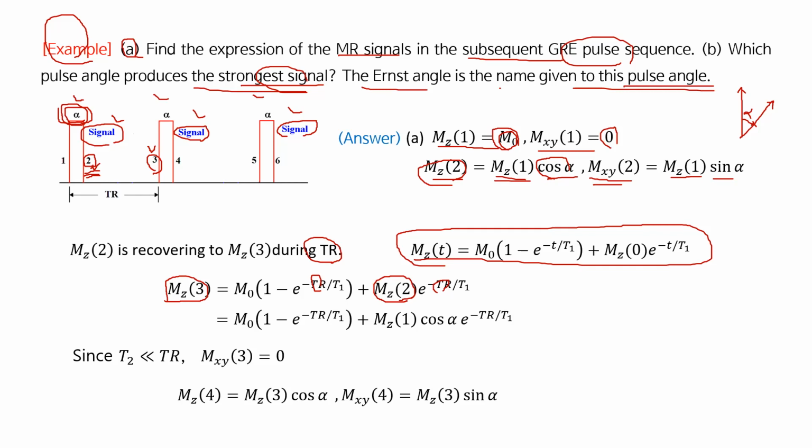And Mz2 is given here. So you can put it here, and then we can have this expression. And T2 is much shorter than TR.